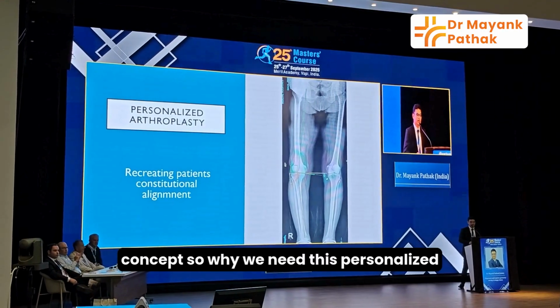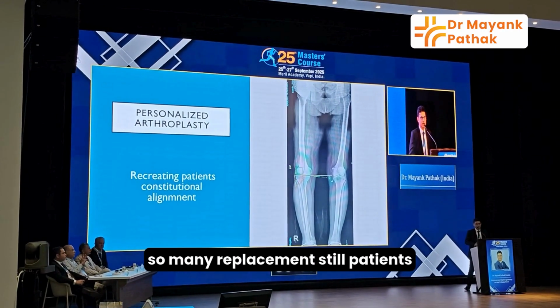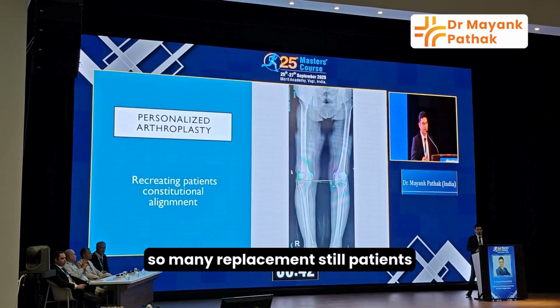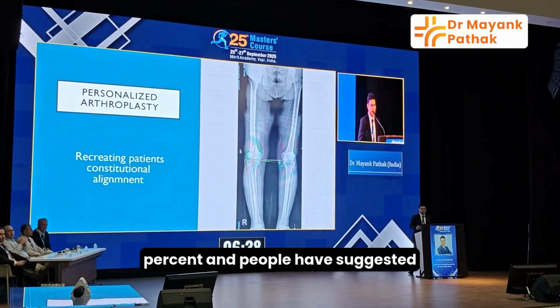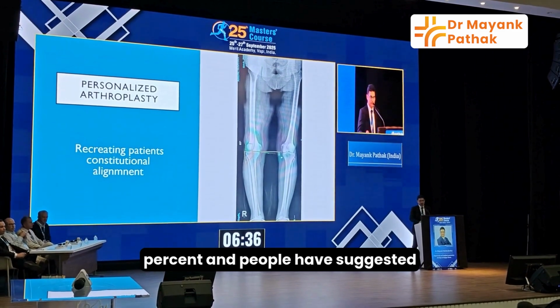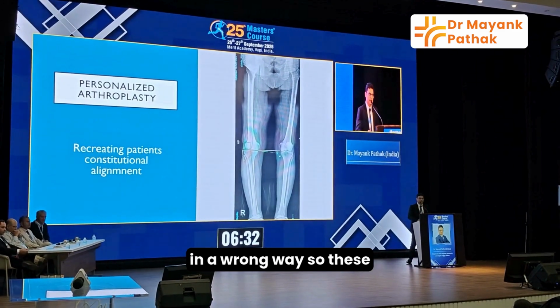So why do we need this personalized arthroplasty concept? Because after doing so many replacements, patients are still not happy, and that dissatisfaction is about 20 to 30%. As a paper has suggested, 30% of implants are placed in the wrong way.